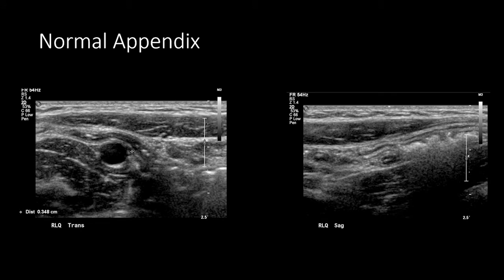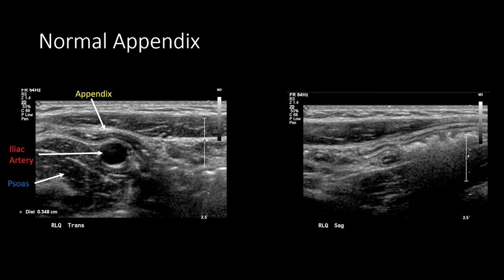Let's talk about what the normal appendix should look like on ultrasound. I have provided two ultrasound images from the same patient who presented to the emergency department with lower abdominal pain. In these images we can see the psoas muscle, outlined in blue, and the iliac artery, which is incompressible, outlined in red. Overlying the psoas and iliac artery, we see a thin tubular structure — the appendix, outlined in yellow. Notice there is a blind end to the appendix, and calipers show the diameter is less than 4 millimeters. In the sagittal image, we can still see the appendix in short axis, with very small diameter, no adjacent fluid, no inflammation, and no wall thickening. This is a nice normal appendix measuring less than 4 millimeters in the expected location, right lower quadrant overlying the psoas and iliac artery.